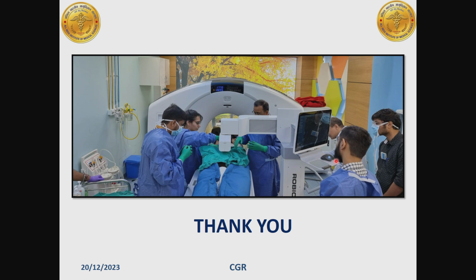Yes, so the dose is entirely different. What we administer for a whole body PET-CT for diagnostic purposes is around 0.15 to 0.2 millicurie per kg body weight, so it lies between 5 to 10 millicuries based upon the patient weight, because that is for the SUV max calculation. But what we do in this procedure is a maximum of 2 to 3 millicuries, because we need to just brighten up the lesion for our needle to be placed in the site of maximum metabolic activity. So the dose which we give is much, much less than the diagnostic procedure.